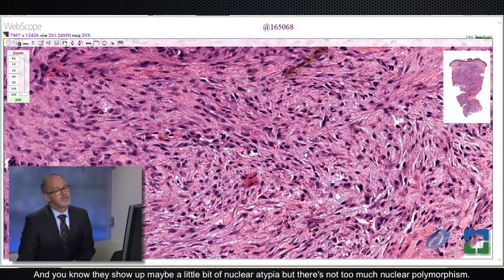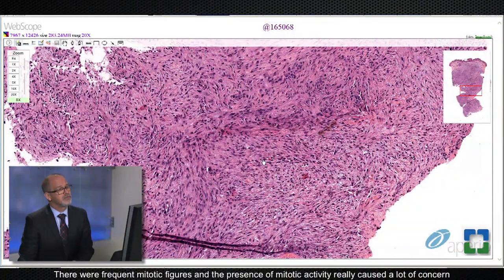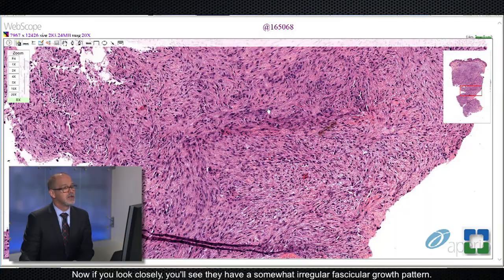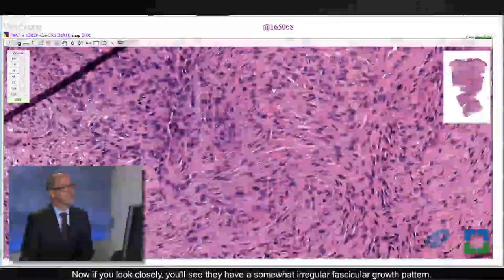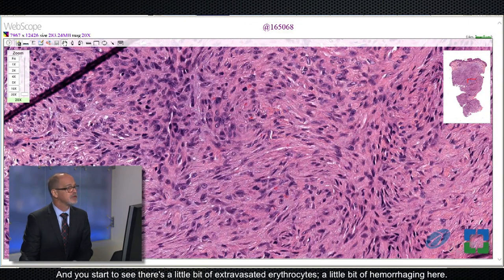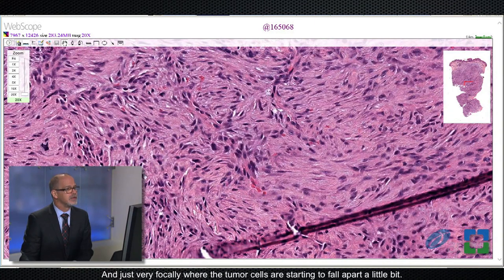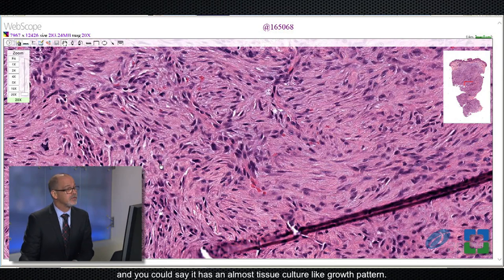They show maybe a little bit of nuclear atypia, but not too much nuclear pleomorphism. There were frequent mitotic figures, and the presence of mitotic activity really caused a lot of concern for the referring pathologists. If you look closely, you will see this somewhat irregular fascicular growth pattern, and there's a little bit of extravasated erythrocytes, a little bit of hemorrhage, and just very focally where the tumor cells are starting to fall apart. You can see that nice irregular fascicular growth pattern — almost a tissue culture-like growth pattern.